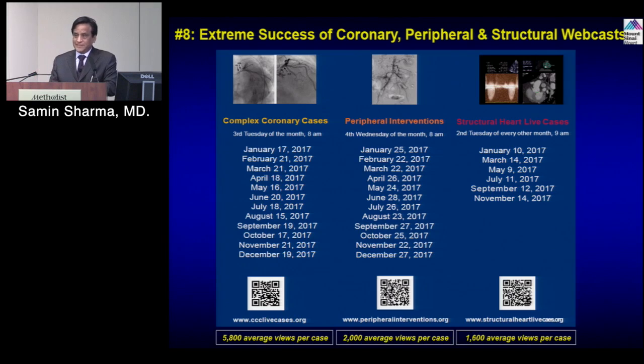Another 5-7% are balloon pump, and those are usually acute MIs. So we don't use the Impella for acute MI cases, but for high-risk cases. And the other 5-6-7% is the balloon pump. But I would say the threshold is about 5%. The reason is that nowadays it is a very high-ticket item, and those are the ones we all have to worry about for the subsequent audit, that we are doing the right thing.